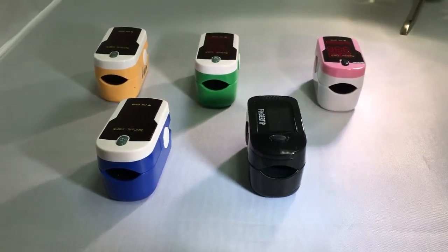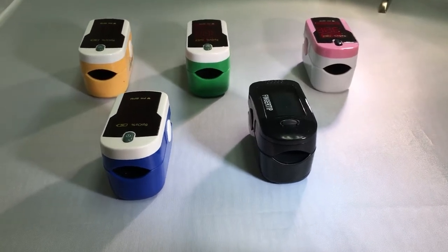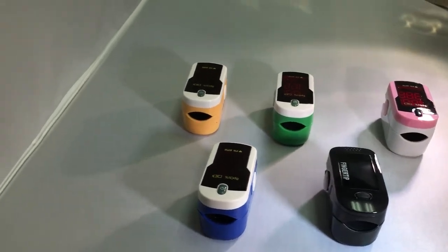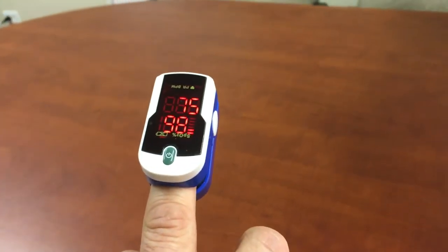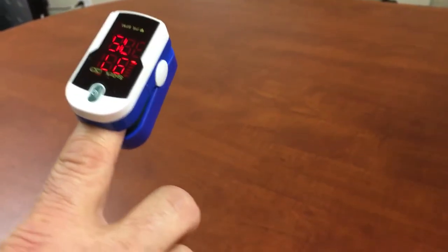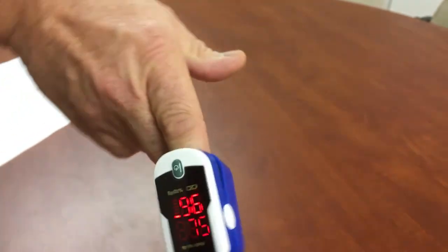This allows the device to be read by the person wearing it or a caregiver. When you first turn on the device, the initial orientation of the numbers is facing the person wearing it. With the push of a button, the numbers flip and can be read from the opposite side.